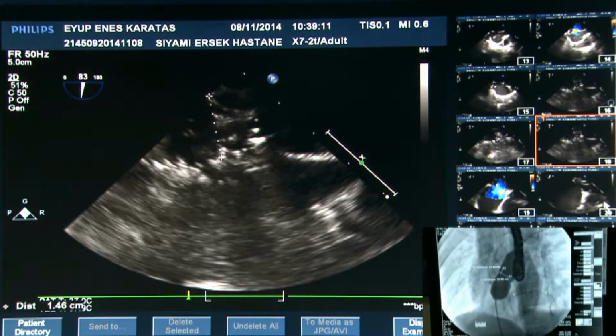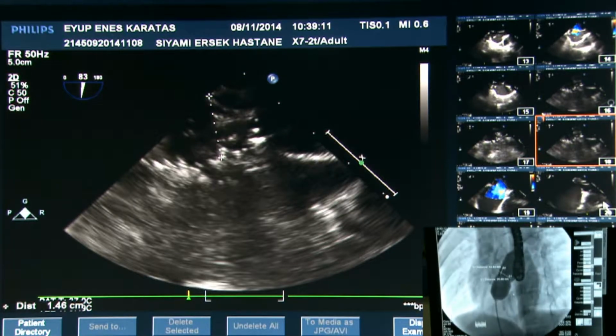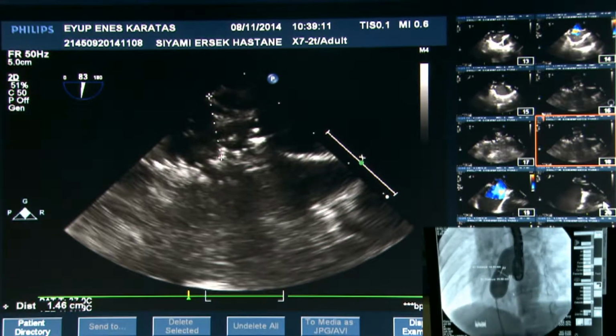Dr. Qureshi, may I ask you, balloon sizing. If you would not do a balloon sizing, and I think the same, if the rims are firm, I usually don't. What size would you select? Well, here on the color, it was 15 and 2D was 14.6. So I would have picked either a 15 or a 16, depending on which device you're using. Occlutech will be 15 and Amplatzer would be 16 or 14. So would you add 2 or 4?